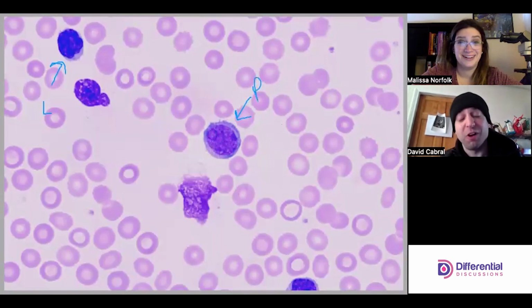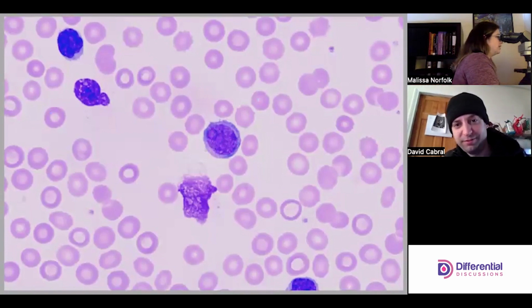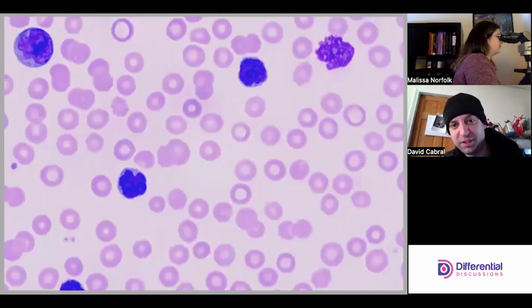And a good one too, right? These are like the teaching ones. There'll always be those tougher calls where one might elect to call it a prolymph and one might not. But this one's pretty clear, I think. That was nice, less controversial. We love the straightforward cells. Me too. Sign me up.